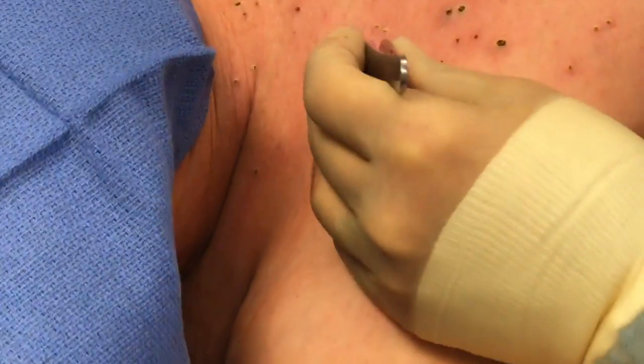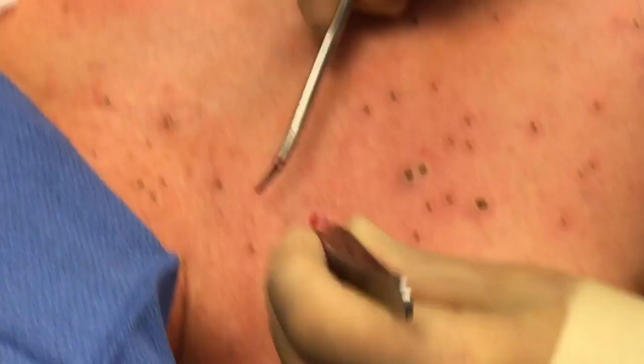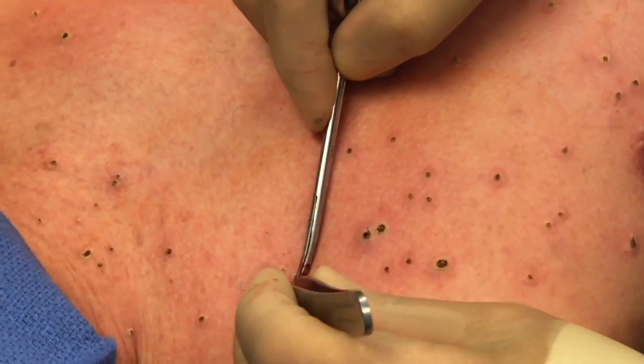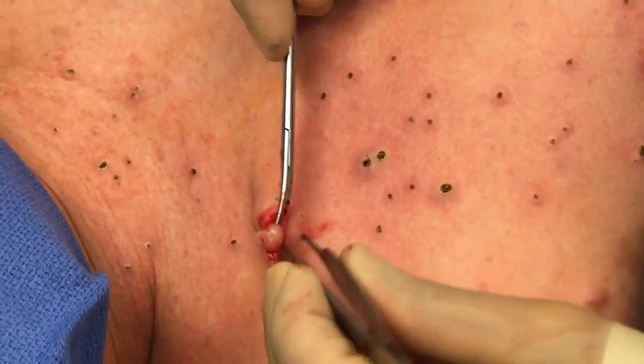What you're seeing there is the neurofibroma itself — now unroofed and coming out of the skin. You can see how extensive it could be in some people. You can almost see the nodular aspect of it. As you can tell, it just kind of comes right out.